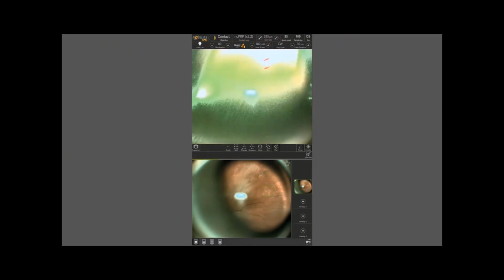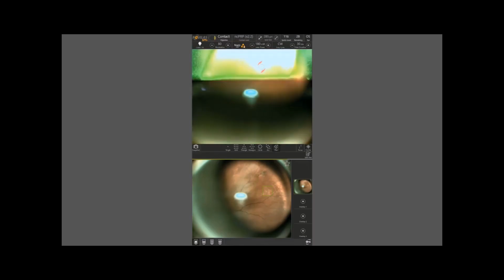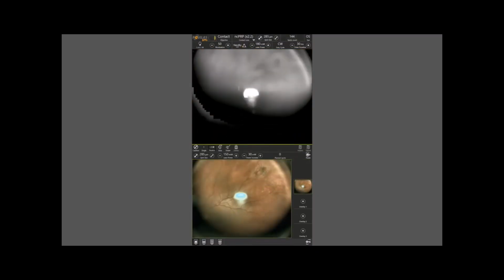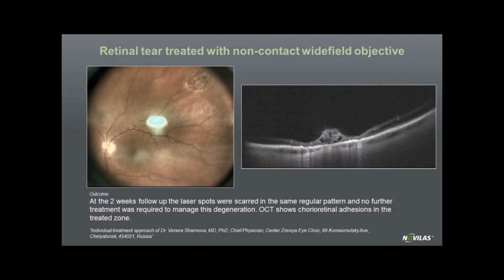Coming back to the treatment we see on screen, it's not speeded up, it's a real recording. The plan is halfway finished already. The patient sits calmly, which makes the treatment very quick. I wouldn't say that every treatment turns out ideal like this one that we see on the video, but in my experience we had many beautiful cases like this on the first day, just following the considerations I'm about to share. By the way, have a look at the second week's results. I think they speak for themselves.